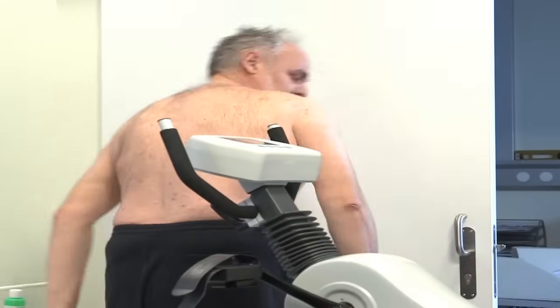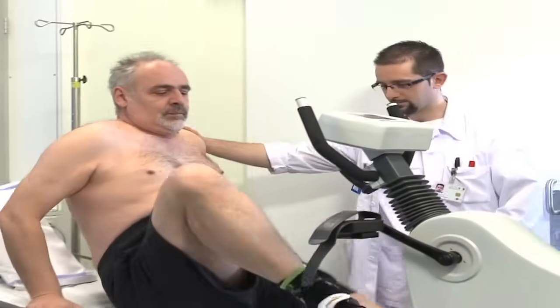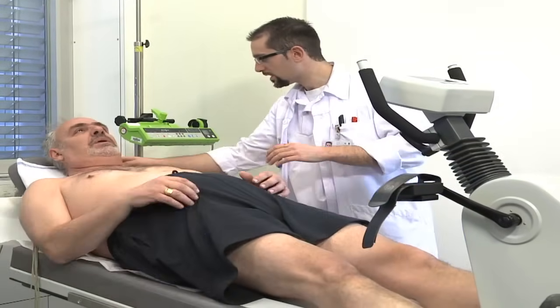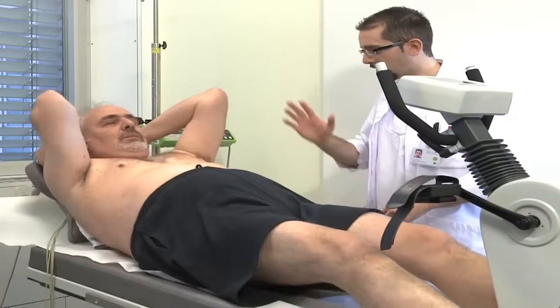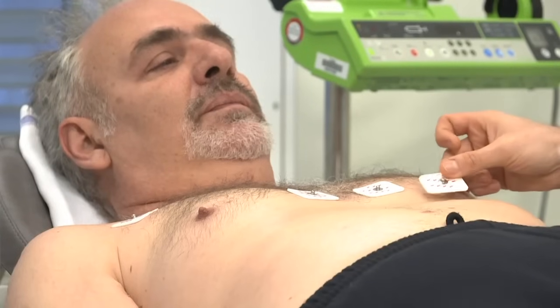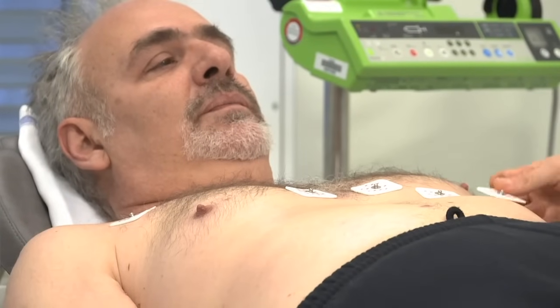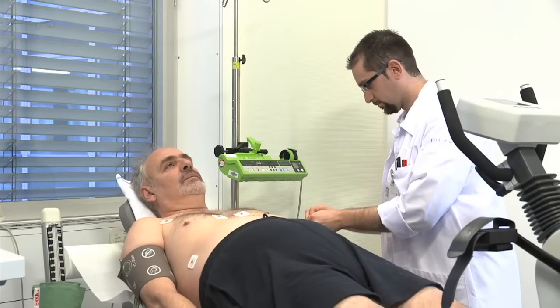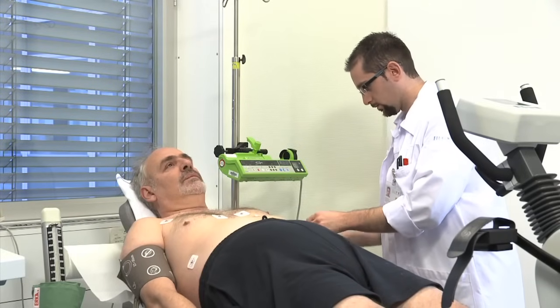Cet examen demande une préparation. Il n'est pas nécessaire d'être à jeun, mais il ne faut pas boire de thé, de café ou de chocolat, ni manger de banane, car ces substances perturbent la qualité de l'examen. Si vous suivez un traitement pour la tension artérielle, comme un bêta-bloquant par exemple, vous devez en discuter avec votre médecin et l'arrêter 48 heures avant l'examen.